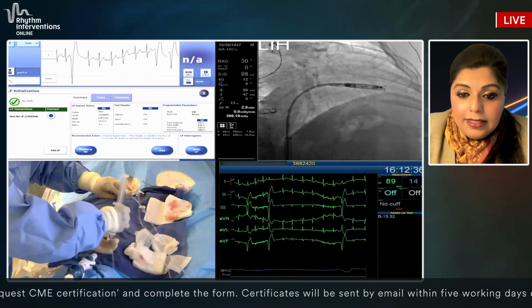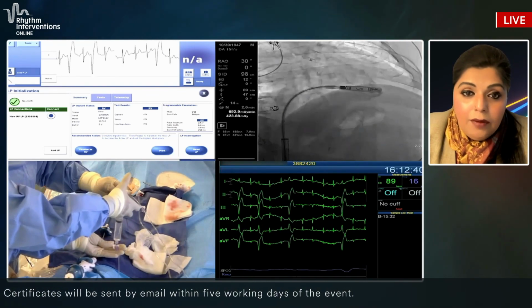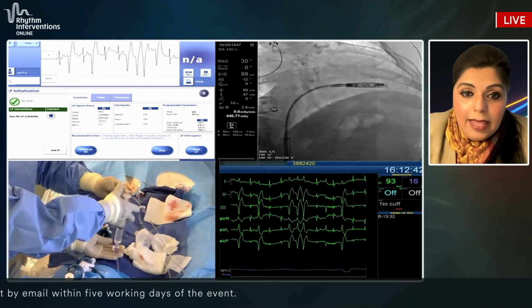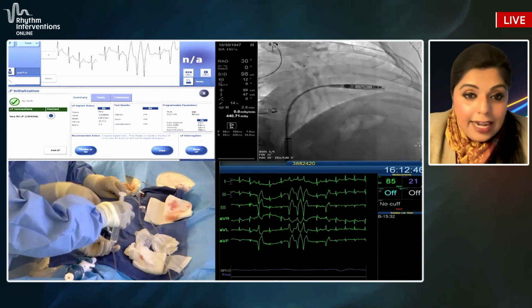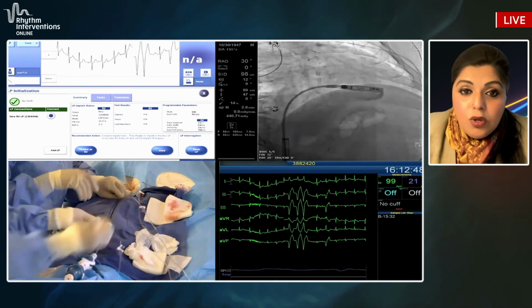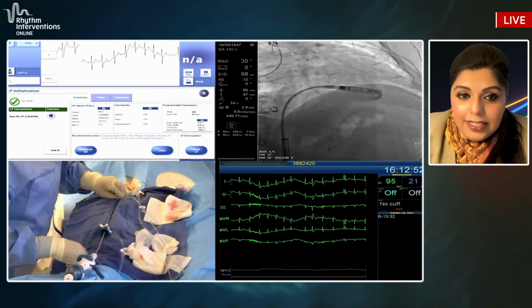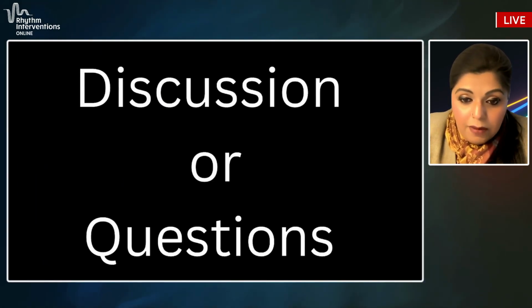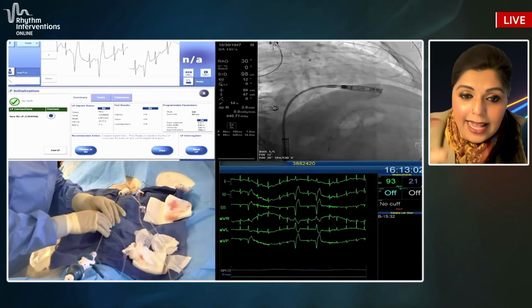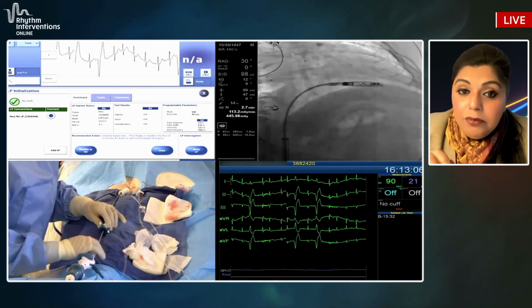Here you can see the next angiogram, confirming that position in RAO as well. And what I'm aiming for is that low kind of apical position. So there's that low apical position in LAO. I knew it was septal. So once I'm happy with that position, I kind of have an idea this is where my annulus is as I bend. So I know that I'm away from it. So as I find that position and I'm happy with that position, now I'm ready to map.